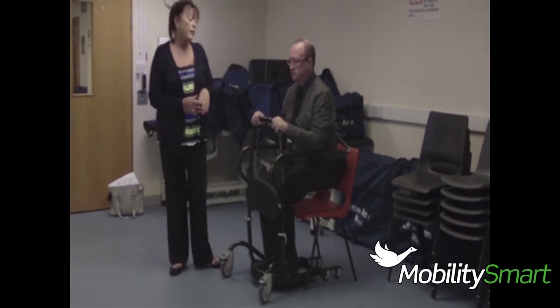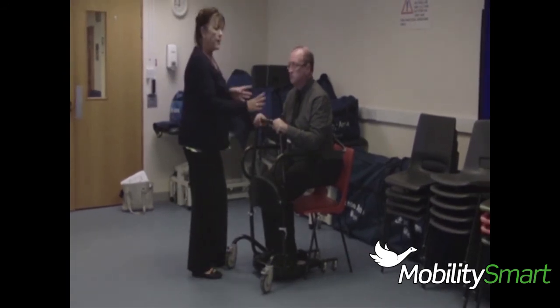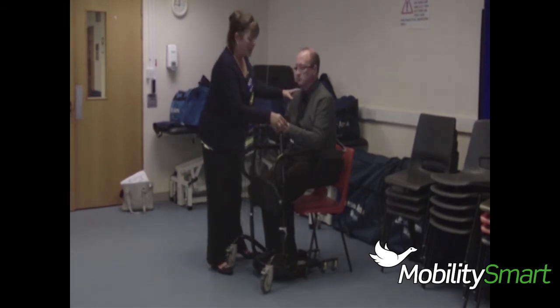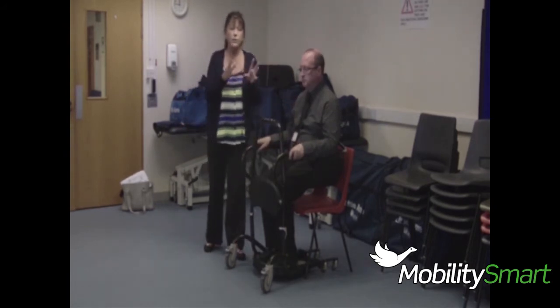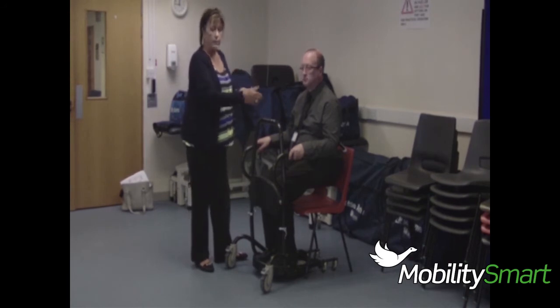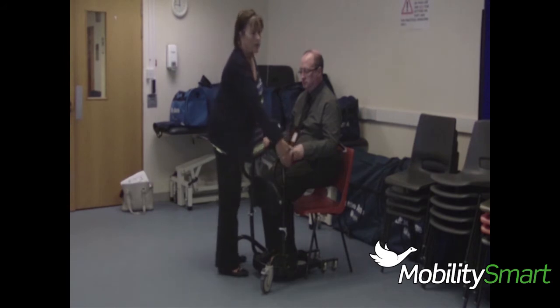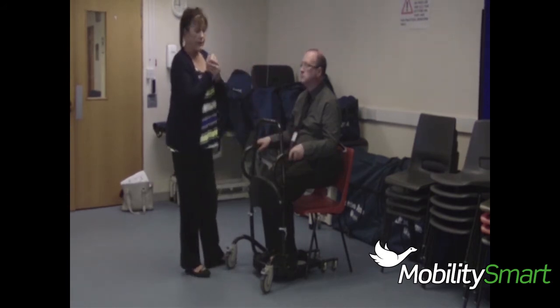Once the client is on the unit, you will always encourage them to hold on to this front bar. Many clients will in fact make themselves comfortable and lean back and put the hands to the side here as if they're in an armchair. But we're going to transport on the Cricket. So as well as doing the transfer, we can move from room to room. The hands are now the widest part of the unit.